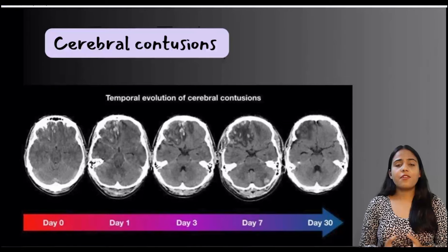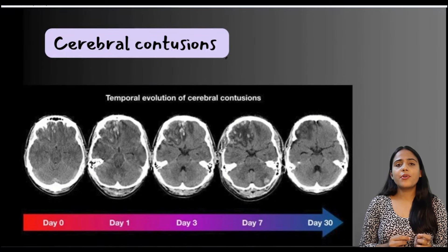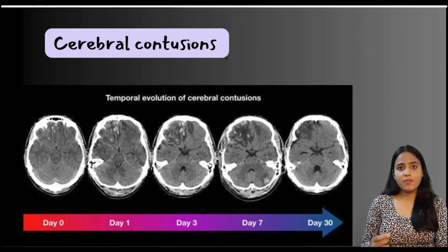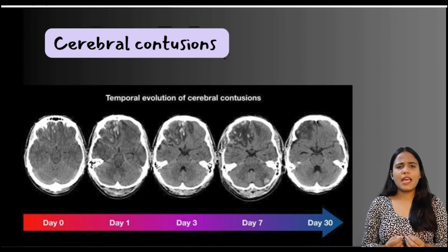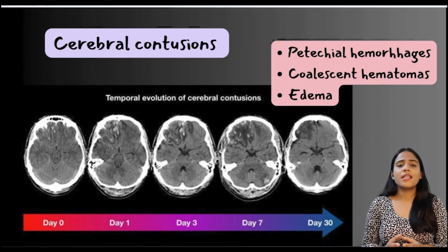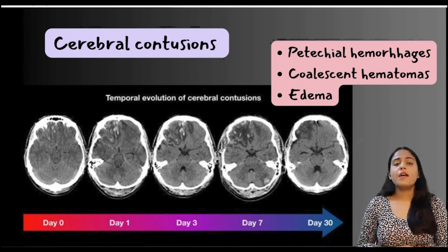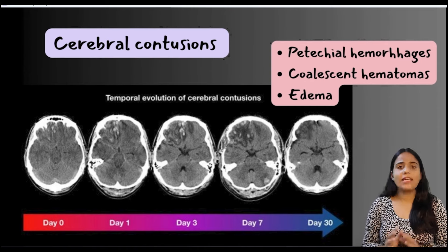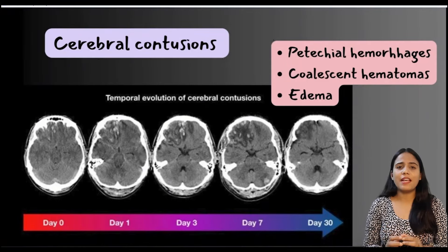This picture taken from Frank Gailard's Twitter shows the temporal progression of a cerebral contusion. Initially we see tiny petechial hemorrhages at the gyral crest near the calvaria. Later on they coalesce and form larger hematomas. In the later stages, these petechial hemorrhages also get surrounded by patchy ill-defined hypodense areas of edema.